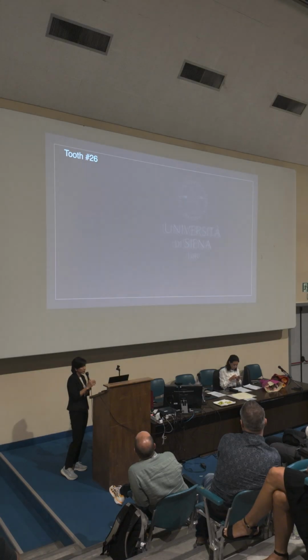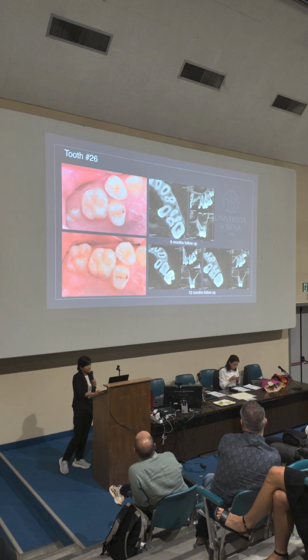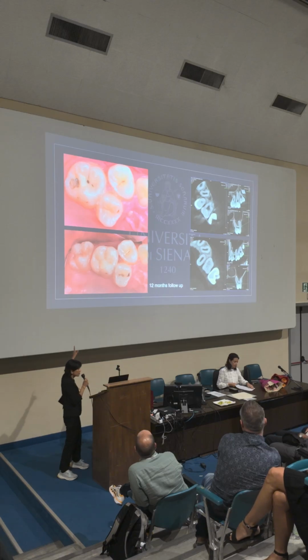And this is the CBCT after the 12-month follow-up. You can compare the CBCT preoperative and at 12 months follow-up. You can see here the sinusitis was resolved with the vital pulp therapy, and you can see in the axial cut, the dentin bridge was formed.